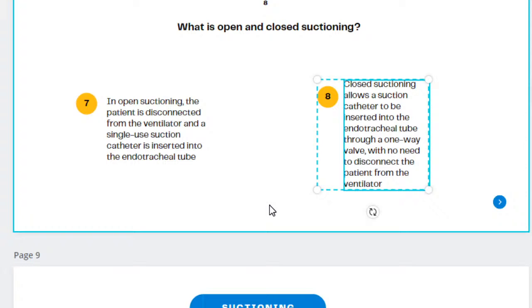When a patient has been on the ventilator for a long time, and everybody comes, the morning shift or night shift or anytime the patient needs to be suctioned, instead of reusing a catheter or bringing a new catheter very often, it's good to keep the patient on an inline suction catheter. That suction catheter is inside a plastic sleeve. No bacteria can get through it. Okay, so let me show you a picture.